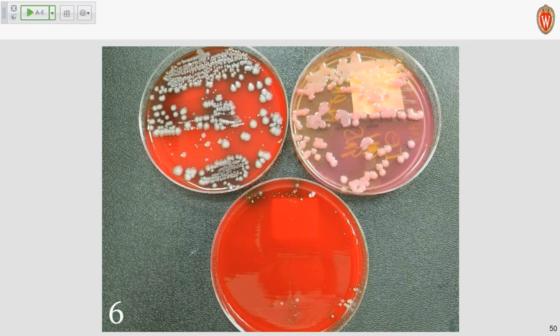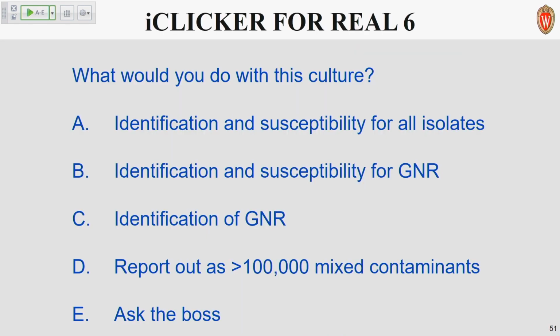Got a lot going on in this one again, too. Doesn't look like much on the CNA plate. No. What do you do with this culture? Same options as before.